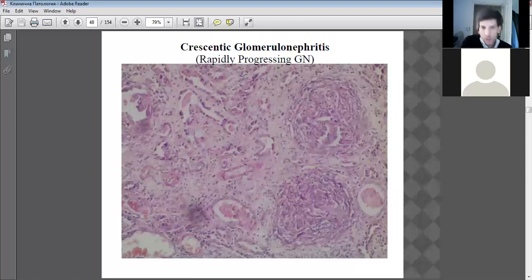This one, the membrane is ruptured, it's broken. This one, the membrane is actually broken and it's bleeding. It's causing bleeding into the tissue. This one is necrotic tissue, all cellular debris.